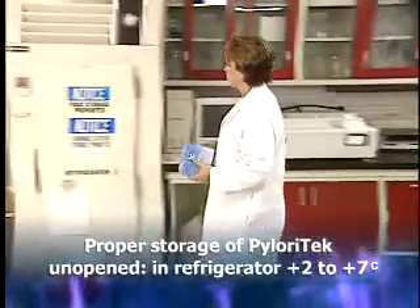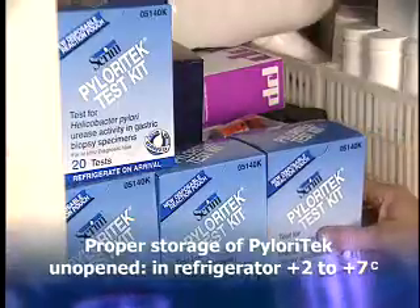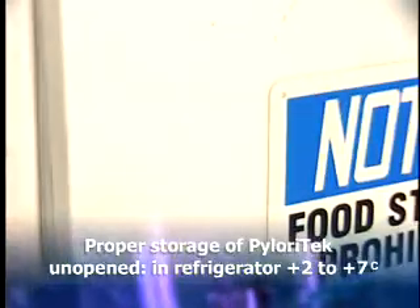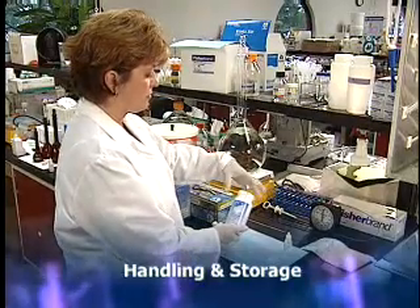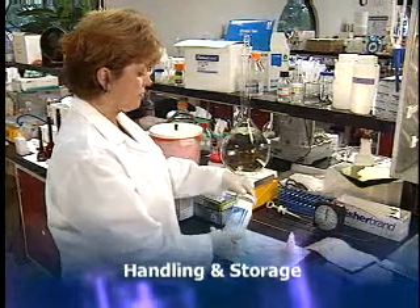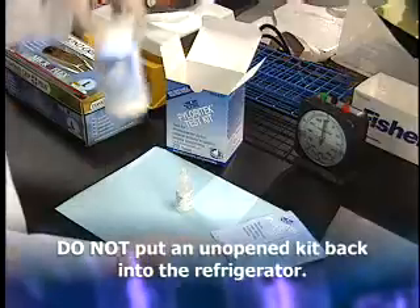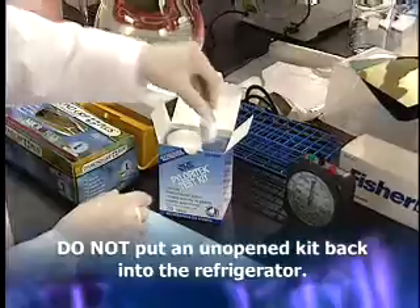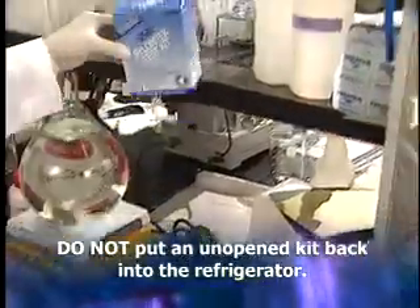Always store unopened PyloriTek kits in a refrigerator. Allow all kit components to come to room temperature — 15 to 30 degrees Celsius, 59 to 86 degrees Fahrenheit — before opening for the first time. Always replace the bottle cap immediately after removing a test strip, and do not remove strips from the bottle until ready for use. Always lay the strip on a clean, dry surface. Do not put an open kit back into the refrigerator; open kits should be stored at room temperature in a dry area, away from direct sunlight or heat sources, to avoid degradation.